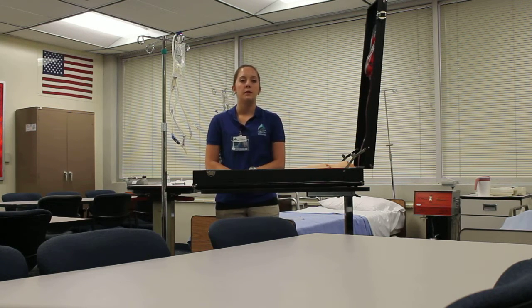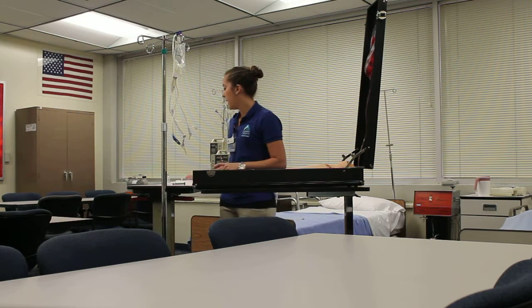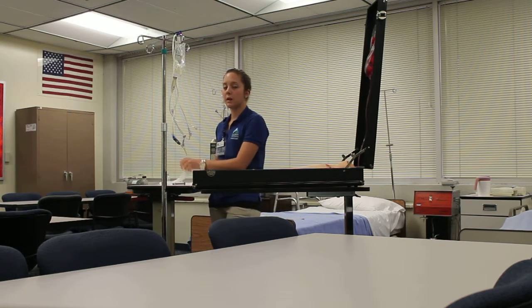I would introduce myself to the patient and identify them using two forms of identity, their name and birth date, and I would check that with their armband as well. I would go ahead and explain the procedure, double check for their allergies, make sure they don't have any, and then I can go ahead and perform hand hygiene as well as put on my gloves.